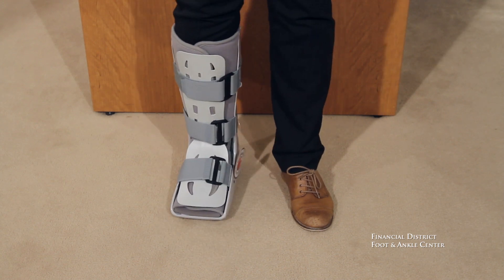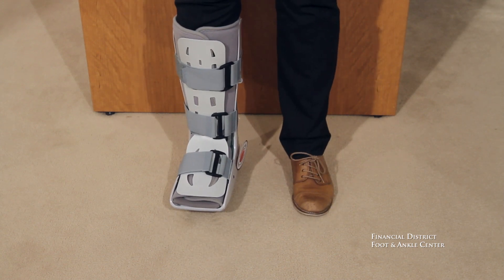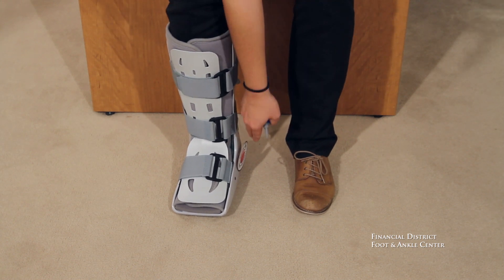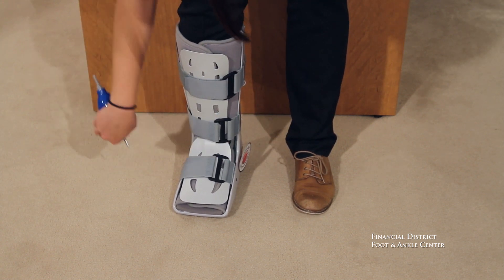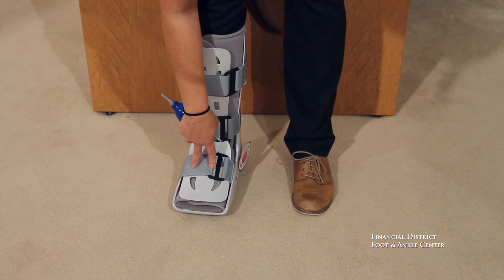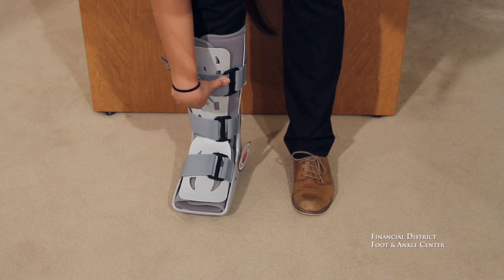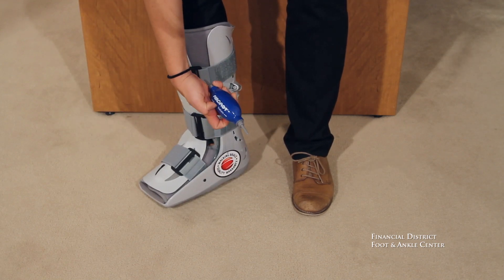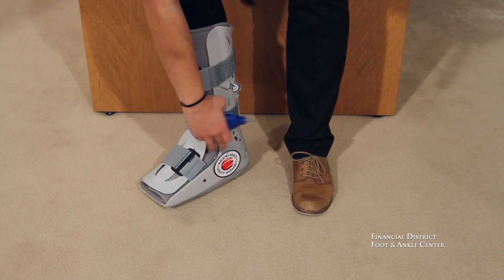Now, when you're making sure that the air cast is properly fit, you want to take a couple steps and make sure that your heel doesn't move up and down or side to side. It shouldn't be too tight or cutting off any circulation. You can always add more air, or use the deflate side to take out air if you've made it too tight.